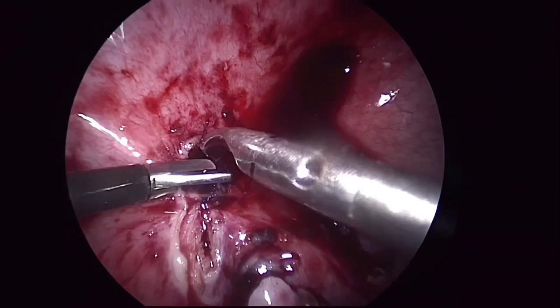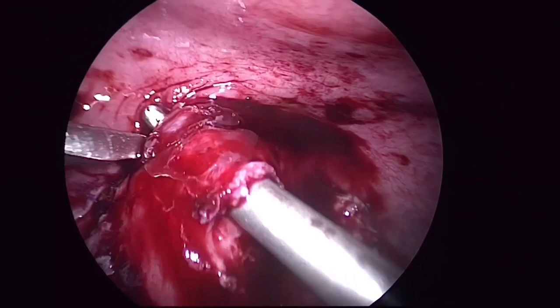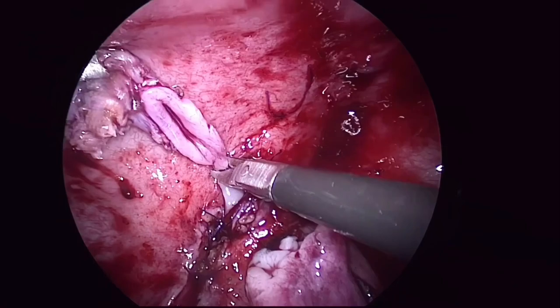Now the submucosal tunnel for the right ureter is created and the right ureter is passed through the submucosal tunnel. The terminal part of the right ureter is then excised, and again the anchoring stitch is taken with full thickness of the bladder wall, followed by mucosa-to-mucosal anastomosis.